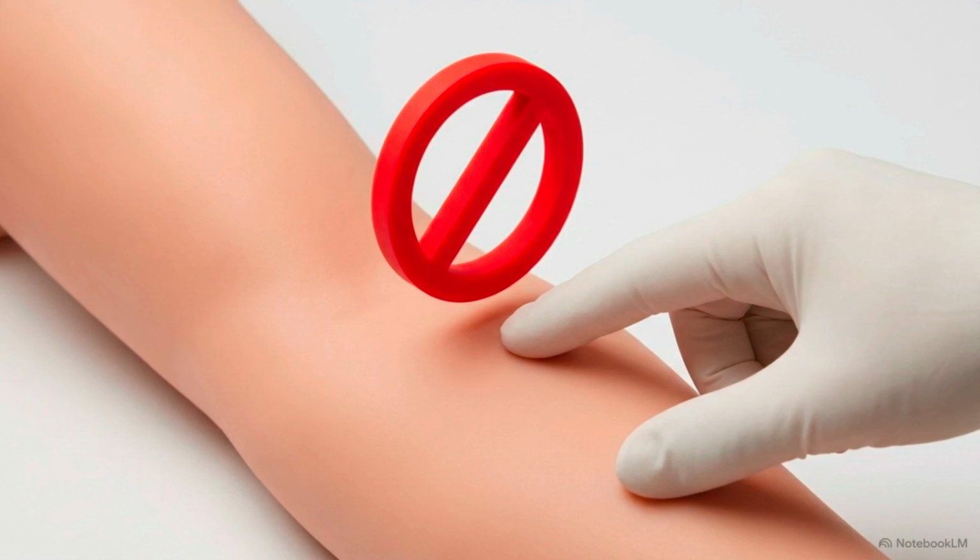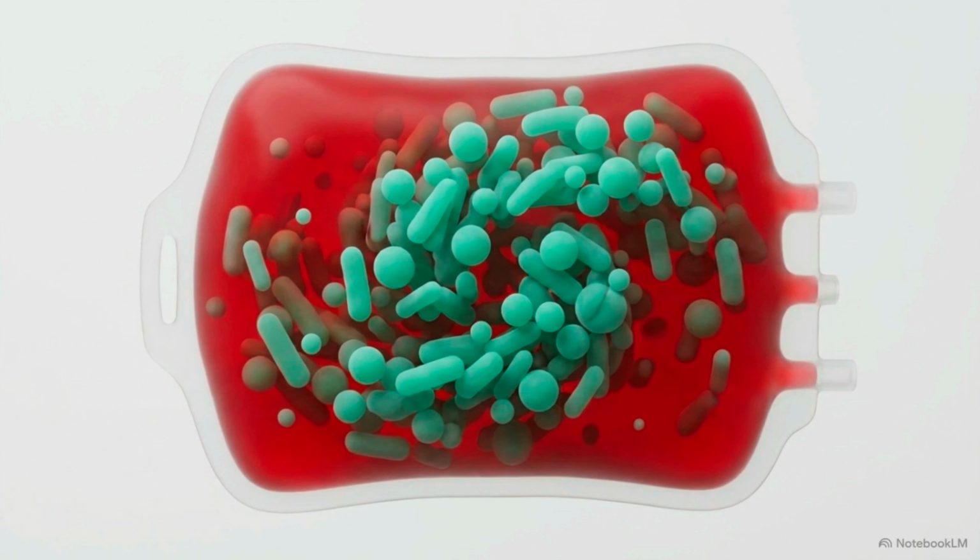Once the site is clean, repalpating the vein is strictly forbidden. Touching the site again pushes surface bacteria directly into the puncture path. If collected into the bag, those bacteria can multiply during storage and cause fatal transfusion-associated sepsis in the recipient.